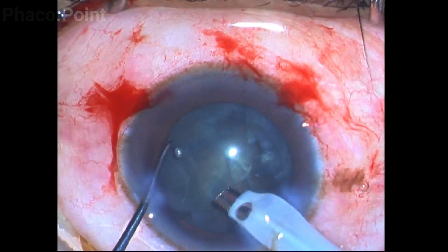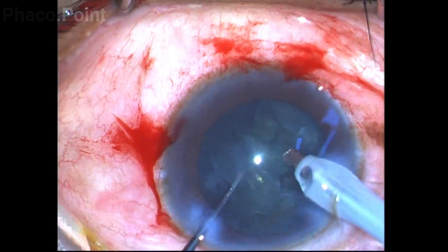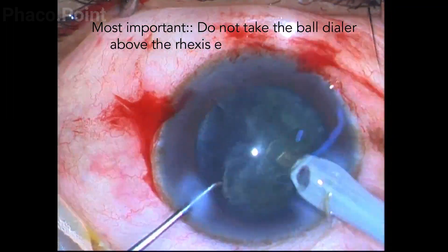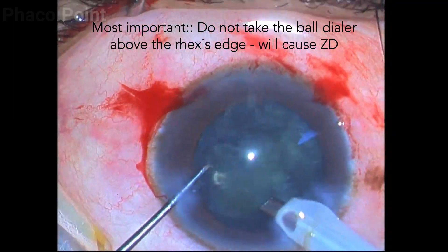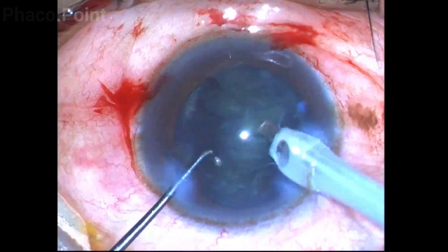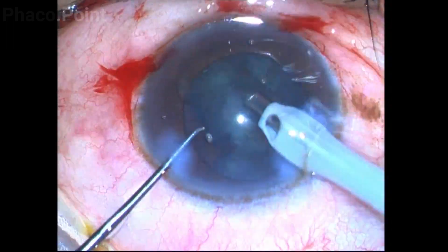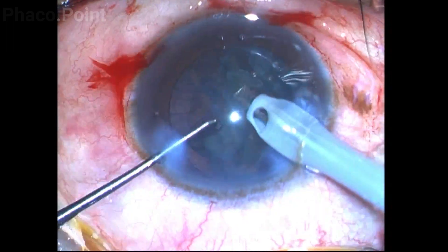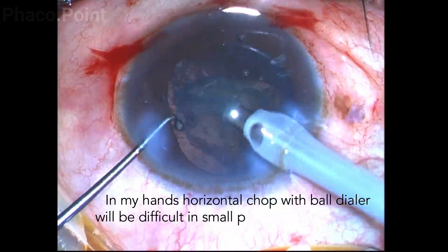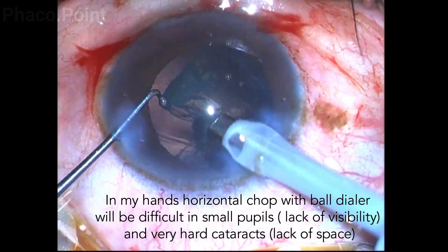It is very important to be mindful that you should never carry the ball dialer above the capsulorexis edge, because if you do this and go to the periphery to chop, this will create a massive zonular dialysis. Hence a very good view of the capsulorexis edge as well as a perfect understanding of depth and distance is important before you attempt to use a ball dialer. For the same reason, it will be difficult to do the ball dialer technique with a small pupil or a very hard cataract.